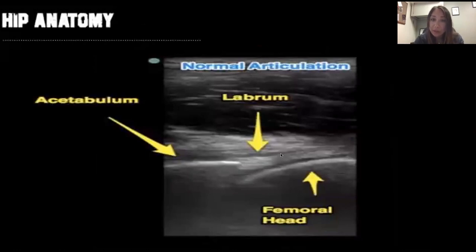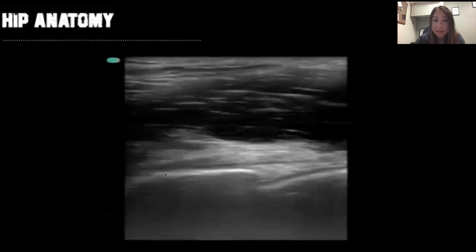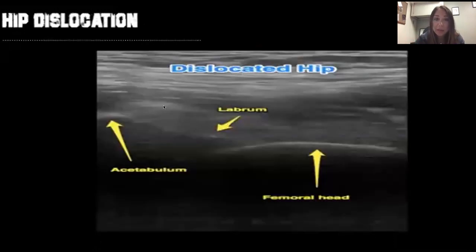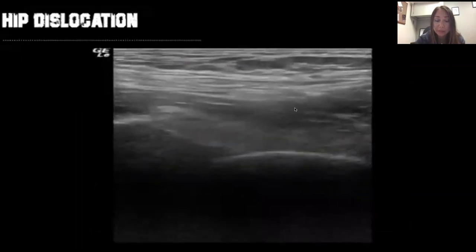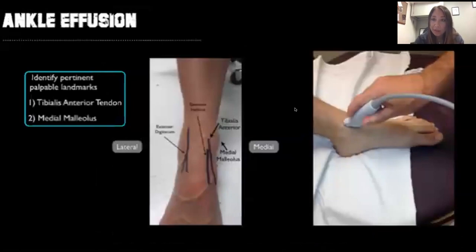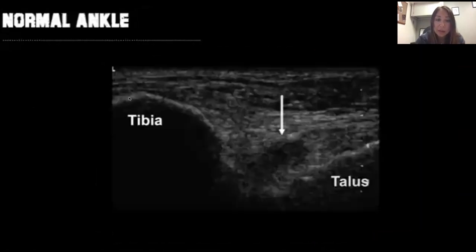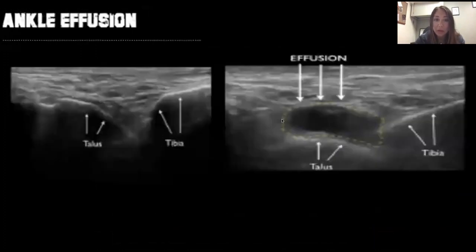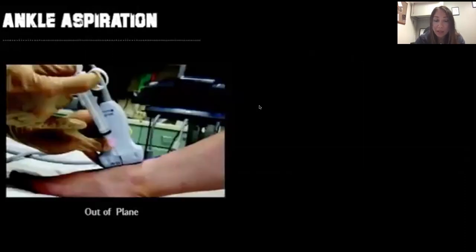We can use ultrasound to look for hip dislocations. Here's the acetabulum and femoral head — normal articulation where everything is in place. With a dislocated hip, there's a loss of normal alignment between the femoral head and acetabulum, confirming dislocation. Moving down the lower extremity, we can diagnose ankle effusions by identifying the tibialis anterior tendon and medial malleolus. Here's the tibia and talus — an effusion would appear as a hypoechoic area here, and we can aspirate it either out of plane or in plane.